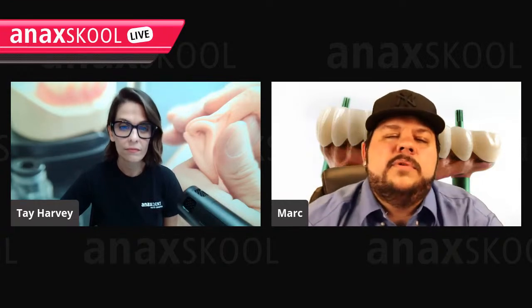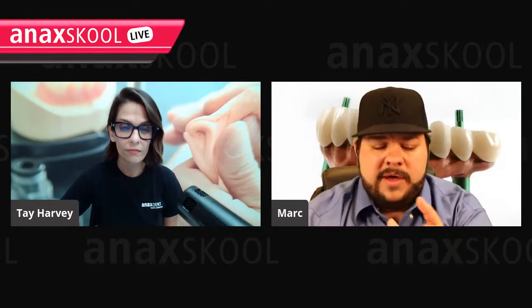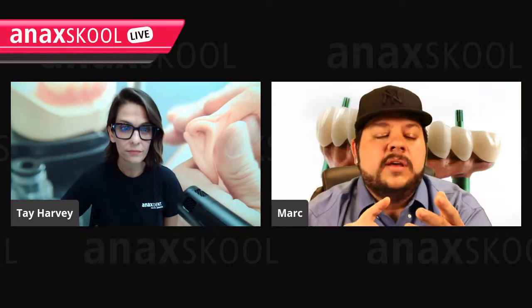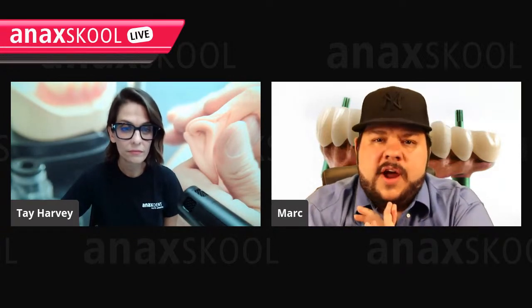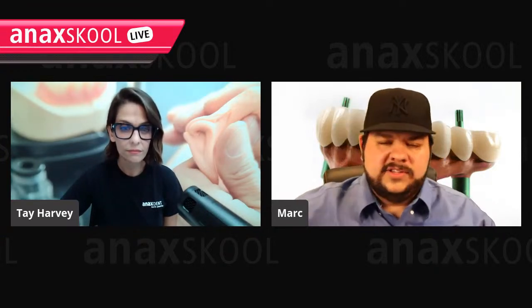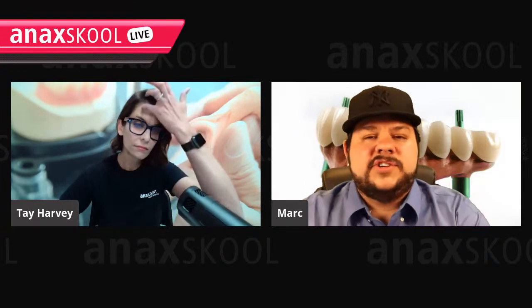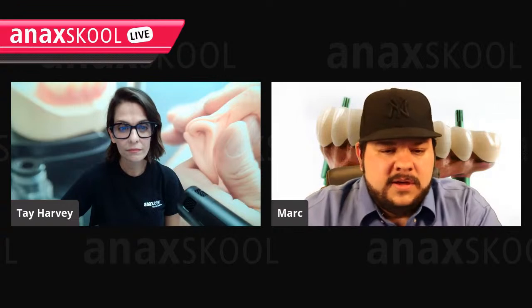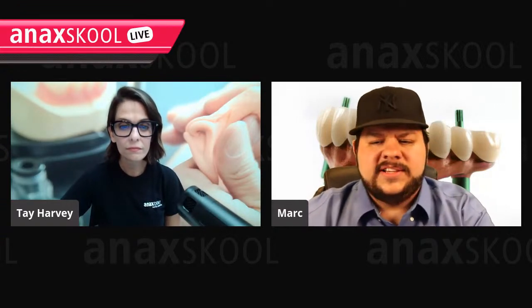So let's pretend we're going to do this the 3Shape way. We're going to build a thimble bridge, a split-file thimble bridge. We want to manufacture the bar, whether it's titanium, chrome, cobalt, or an HPP like Pekton, or just a try-in. Maybe you're going to print a try-in. It's really economical, you print it in minutes, it's out the door, and it's a lot of information to deliver to your client at once, so swiftly. So we're going to pretend that we have a diagnostic wax-up and we did it, and we're going to get started on this order.